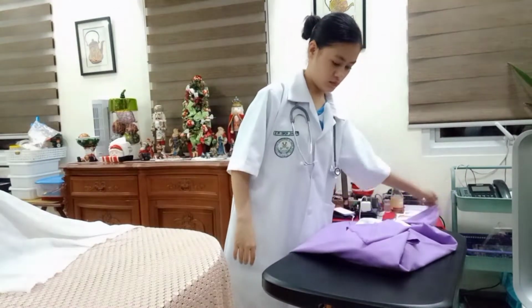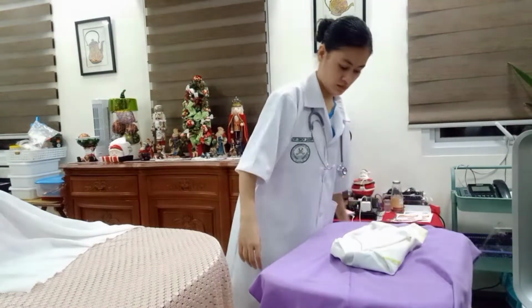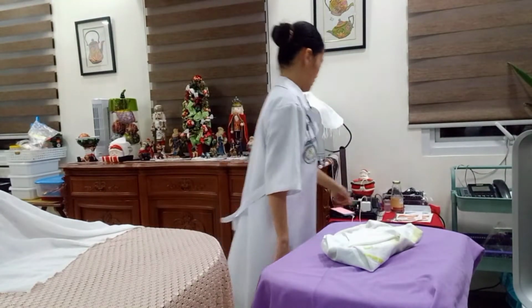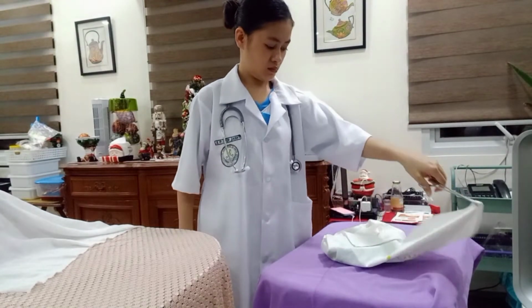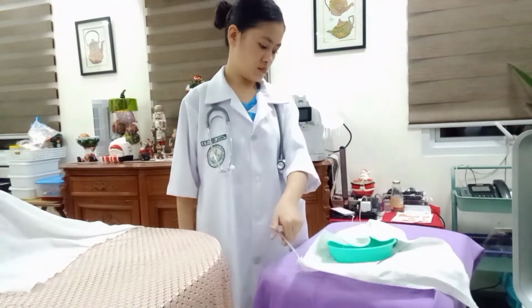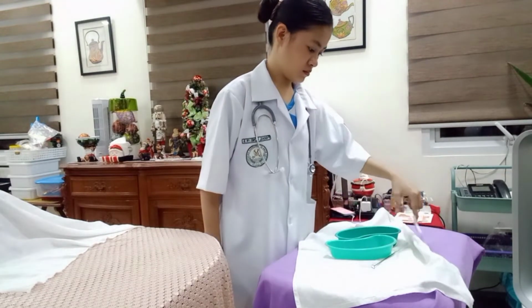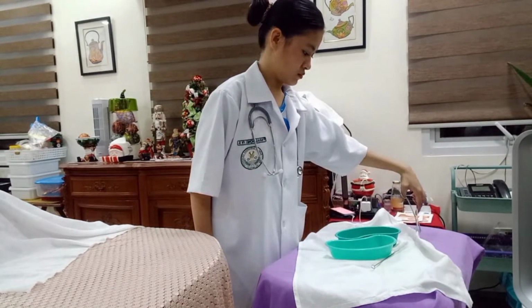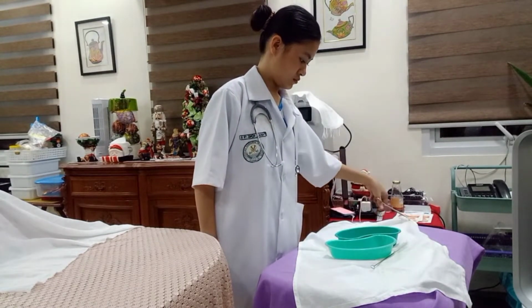For the rationale, it helps maintain sterility during tracheostomy care, so preparing the equipment before beginning care ensures efficiency. So the hydrogen peroxide is used to clean the inner cannula, faceplate, and tracheostomy site. So normal saline solution is used to rinse the inner cannula, faceplate, and tracheostomy site after they are cleaned with hydrogen peroxide.